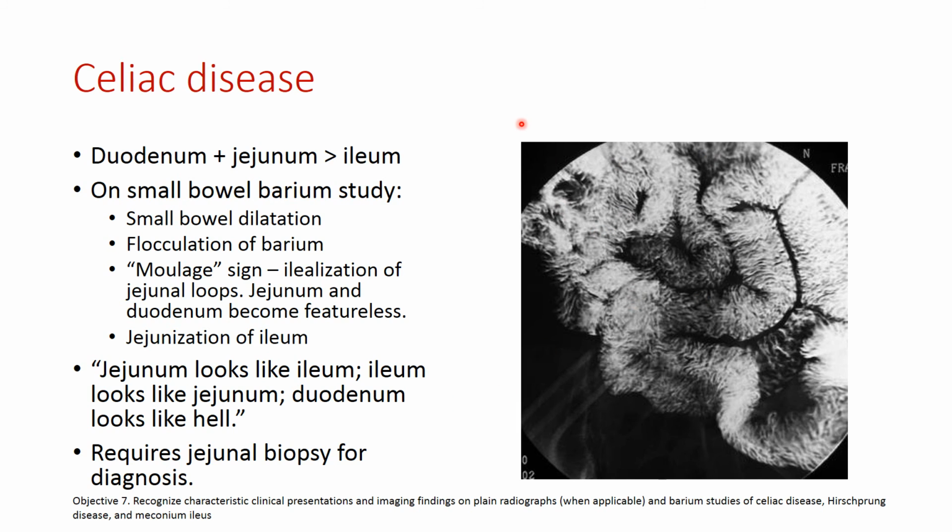And so these are kind of typical findings for celiac disease. We really require biopsy for diagnosis of this, though.